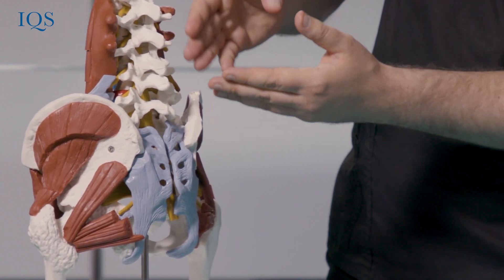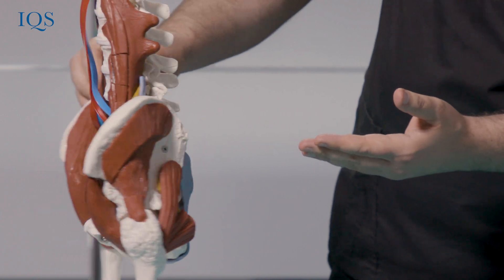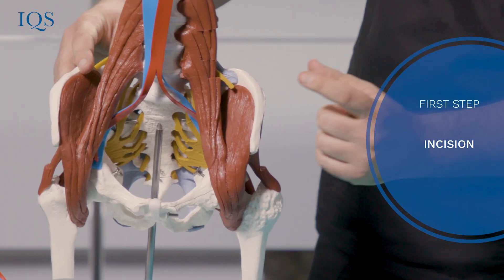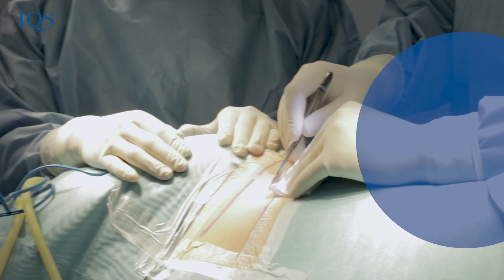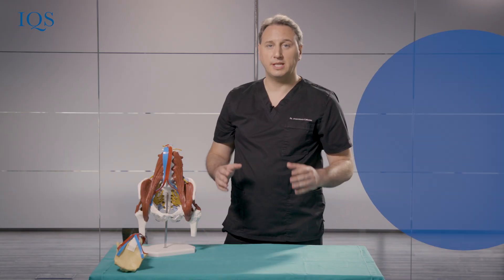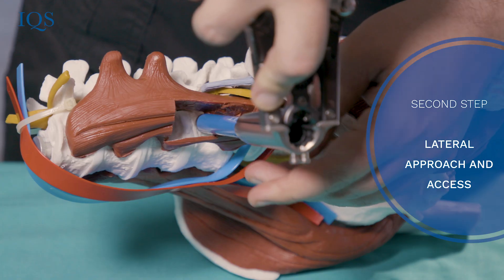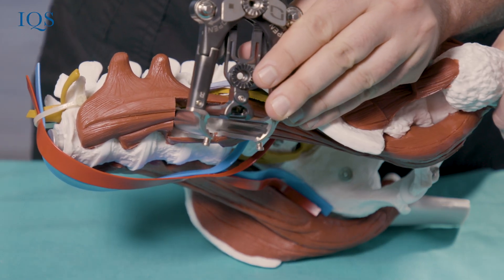First step: a small incision is made in the lateral part of the abdominal wall. Second step: direct access is made through the psoas muscle while continuous neurophysiological monitoring is performed.